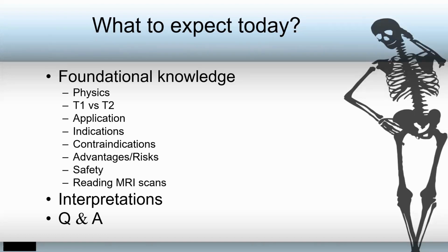Now, before going to the next slide, when you look at an MRI, you usually don't see a physician, surgeon, or you as PTs order MRI for the wrist joint, for the elbow joint, or for the foot. You usually see MRIs for the spine, mostly spine, probably 70% of the time in your clinic, hospital, or wherever, you always look at MR of the spine to see if there is any disc bulge, disc herniation, and if there is any compromise in the nervous system or neural structures.